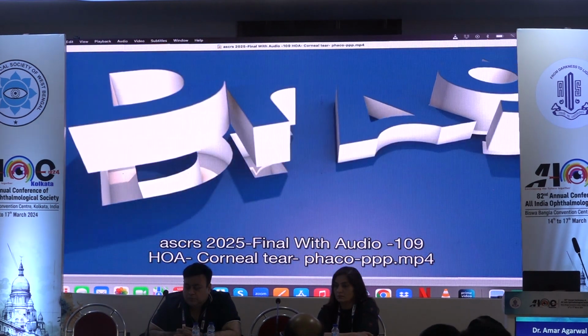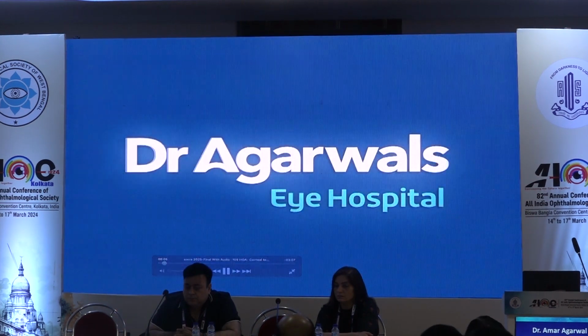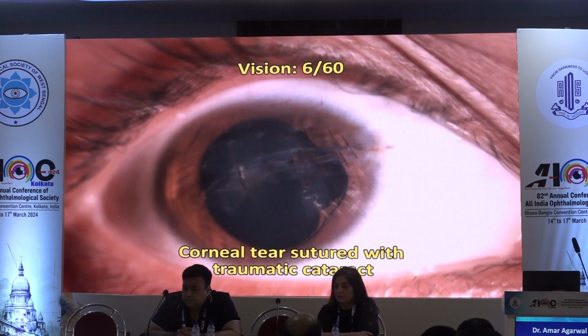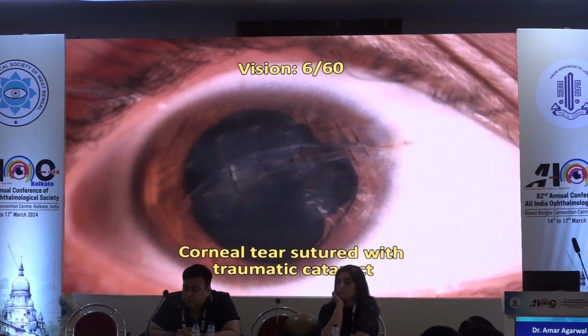To be honest with you people, we are doing a lot of keratoplasties in our center, about 120 a month, which is one of the highest globally if you ask. But now I started doing cases like these, where anyone will think of, let's do a straight PK. I'm saying no. Can we manage them without keratoplasties? Now look at this case. I've got 5 minutes left. So look at this patient.